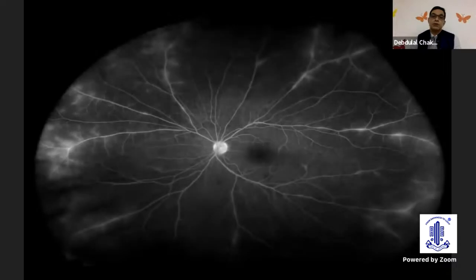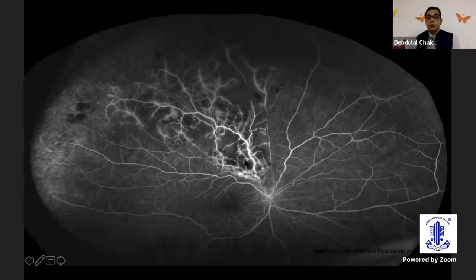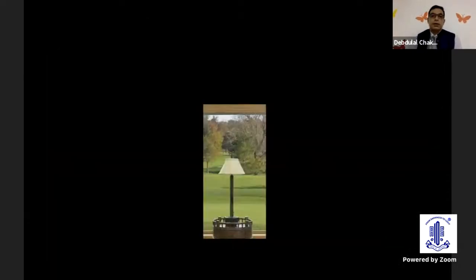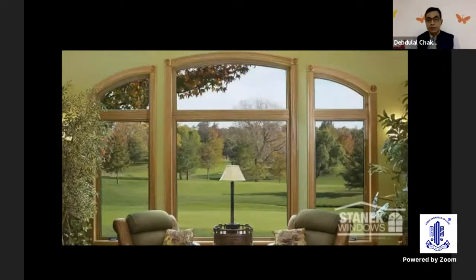Of course, Dr. Dobra will be speaking on uveitis, and of course, you can image vasculitis with the Optos. And going back to the retina, this is a BRVO, and you can actually see how much ischemia is there, and whether to do laser or not, or whether to let it go, you can decide with these Optos images. So everybody likes to have a good view, but this view is definitely better than the one previously shown. So it's the same for the retina.